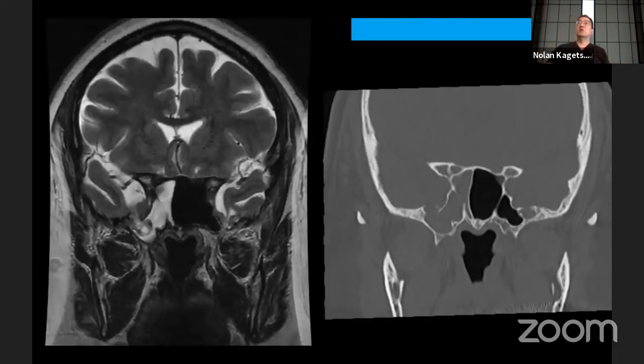Okay, this is a patient that they thought might have had sinusitis, and I actually had an ENT colleague that showed me images and said, hey, there's this opacified sphenoid sinus, and there is fluid in the sphenoid, and the ENT surgeon says, I want to go and drain that fluid because I think it's bothering the patient. It was not this patient, but a similar patient. And then I said, that fluid is actually connected to the CSF, and that fluid may in fact be CSF. And so they said, oh, thank you so much. I think I'm not going to operate on that patient.